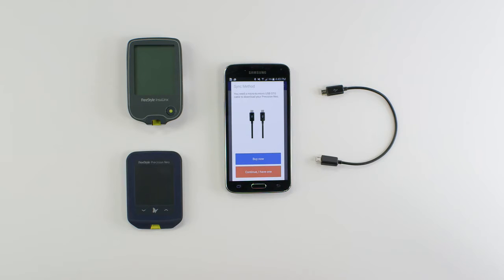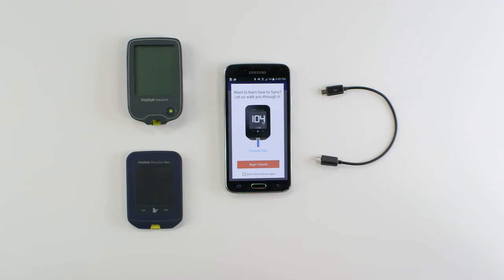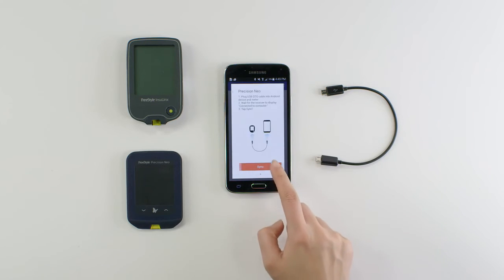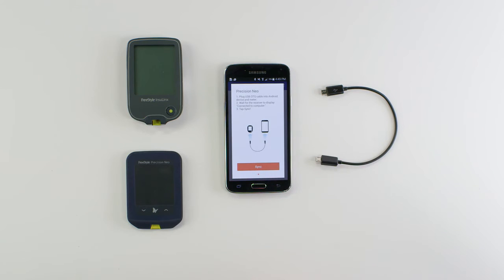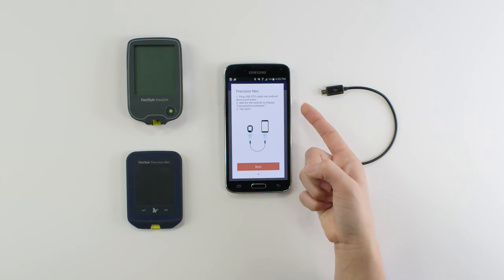Since you already have a micro to micro cable, just tap continue. On the learn to sync screen, tap begin tutorial to see steps on how to set up your freestyle device for data transfer.